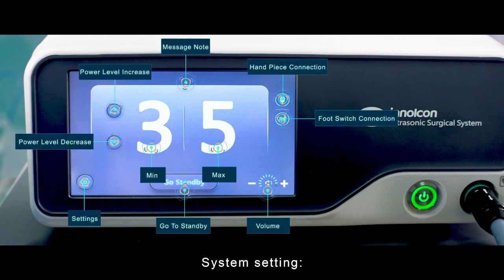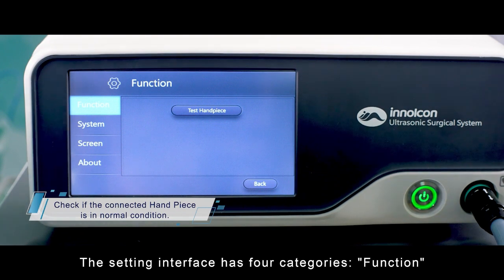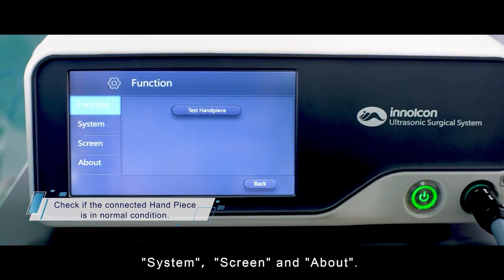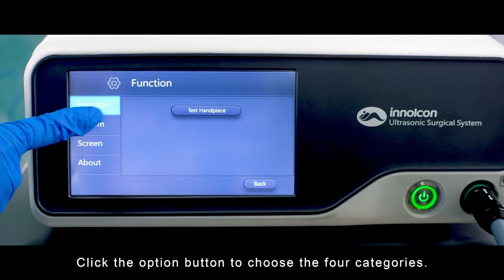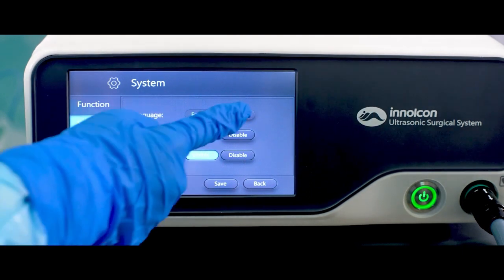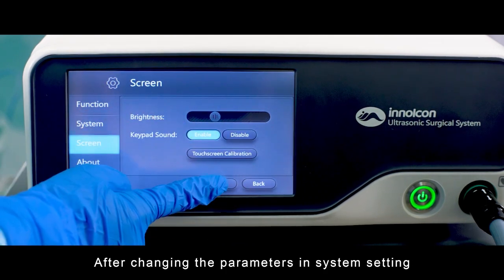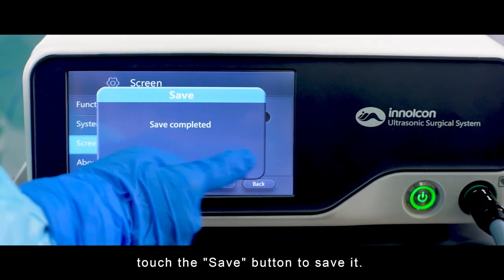System setting. The setting interface has 4 categories: function, system, screen, and about. Click the option button to choose the 4 categories. After changing the parameters in system settings, touch the Save button to save it.